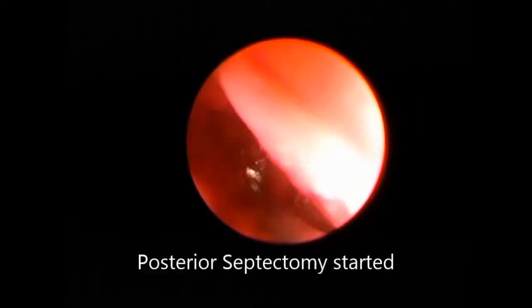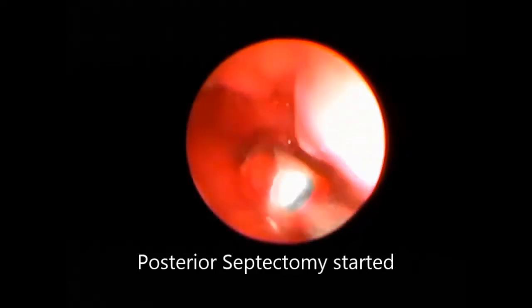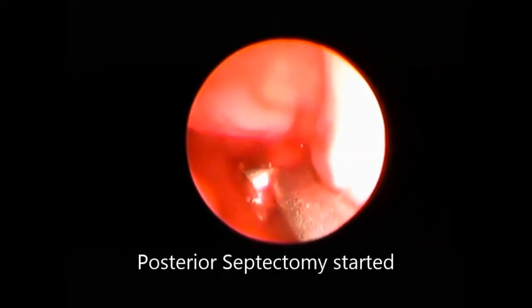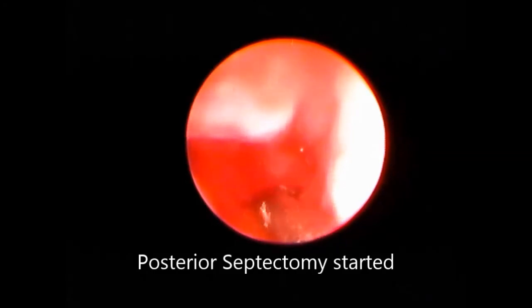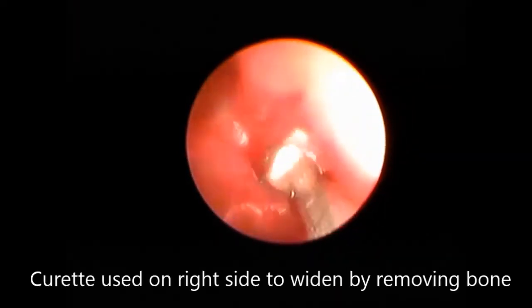Going into the nasal cavity, the use of a micro-debrider was not possible. We planned for a bi-nostril approach where we not only dilated the respective choana but also performed a posterior septectomy, so that we could have a bi-nostril approach — from one nostril we introduced the debrider and from the other we introduced the endoscope. This also helped in giving a rectangular choana, which has less chance of re-stenosis, while two circular choanae have higher chances of stenosis.